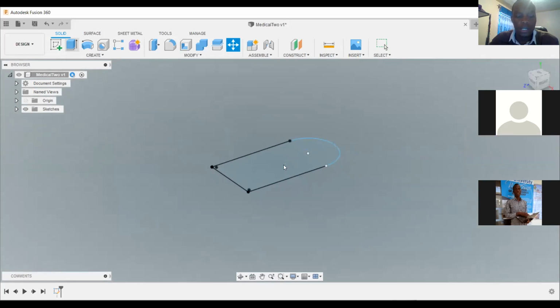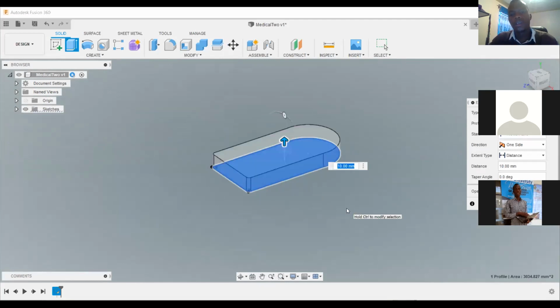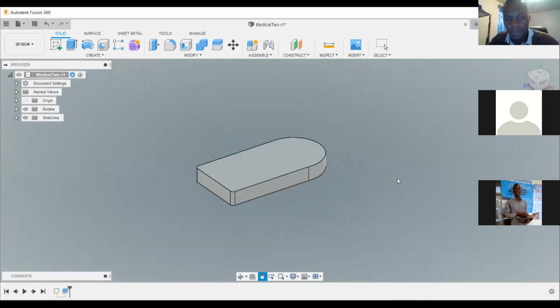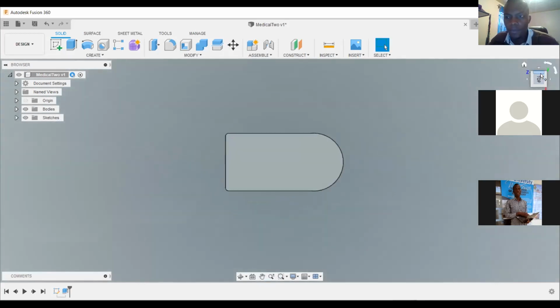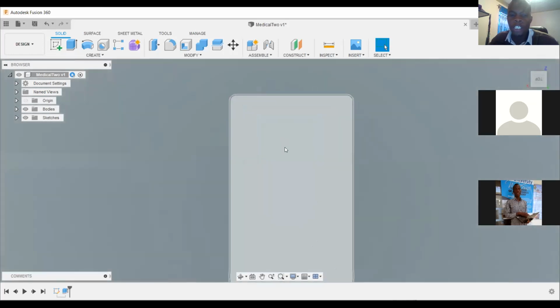Okay, so let's extrude it. You click on extrude, then you click on the surface. Then say we want to extrude it for 10. Then click OK. Everyone, can you see that? So you can change the orientation. You can click on the arrows on the box, and then you change the orientation.